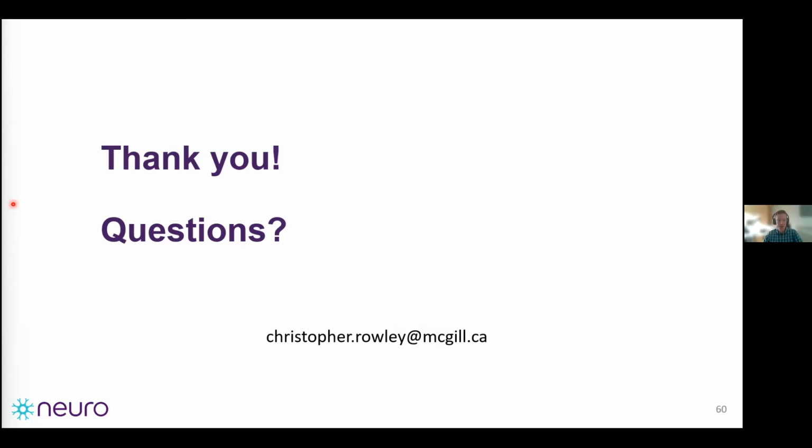Definitely. My experience with the MP2RAGE has been very good, especially with the compressed sensing one. So it seems like a no-brainer if you can get access to that sequence to use it, because we have it running at about 4 minutes to get a very high quality T1 map. I would just use that, and it segments quite well with FreeSurfer. So it doesn't make sense to me to acquire a different anatomical than to just use that, because you're getting a bunch out of that one image.